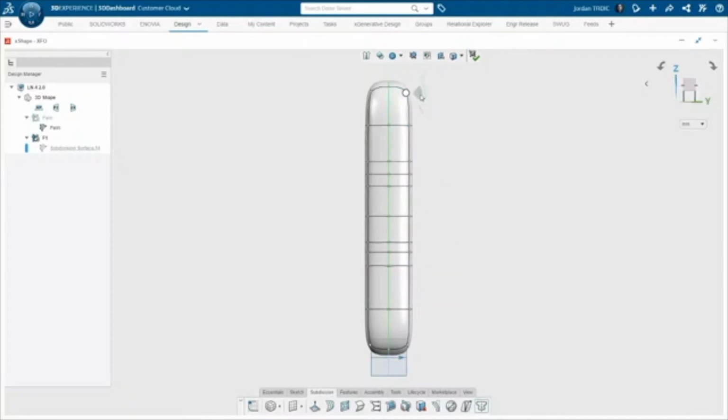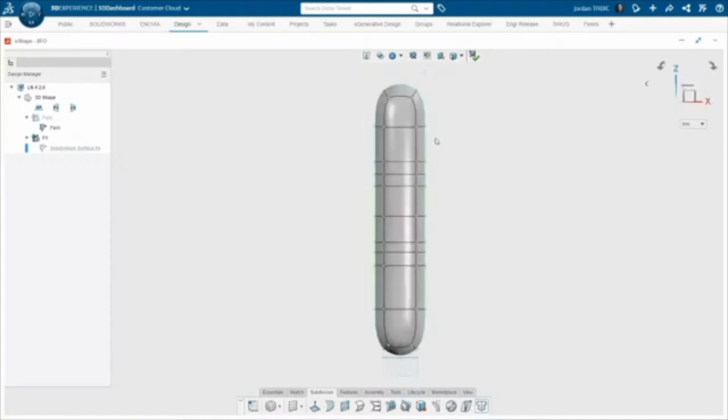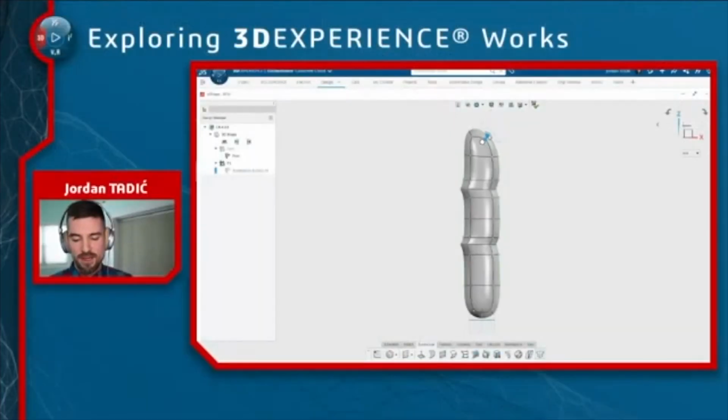So from this front view, I'll taper off or round off the tip of the finger. And then my next step is to go to another view and make it look more accurate from that view. So double clicking those edges, I can translate the little wrinkle in the finger backwards, but the knuckles kind of look awkward, right? They're too sharp. So I could window select that, scale it outwards to soften the radius.